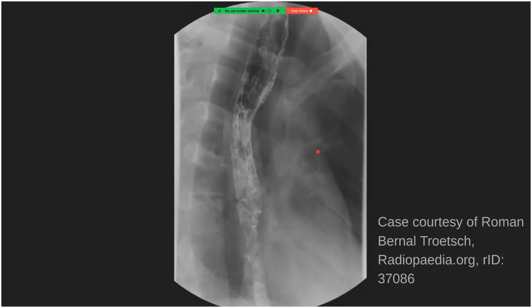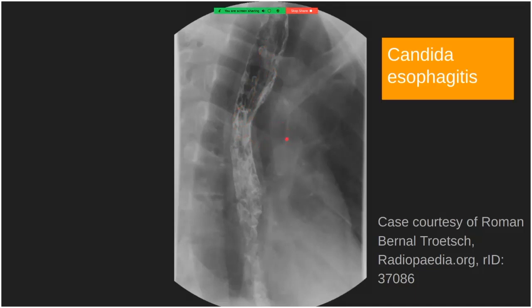This double contrast esophagram shows parts of the esophagus that are normal, but there are multiple areas of mid and lower esophagus with a shaggy appearance — multiple small filling defects and small ulcers. Ulcers appear filled with contrast on barium esophagram, while plaques and polyps appear as filling defects. This is the typical appearance of candida esophagitis, the most common type of infectious esophagitis, most commonly appearing in immunosuppressed patients. The typical appearance is described as shaggy mucosa.